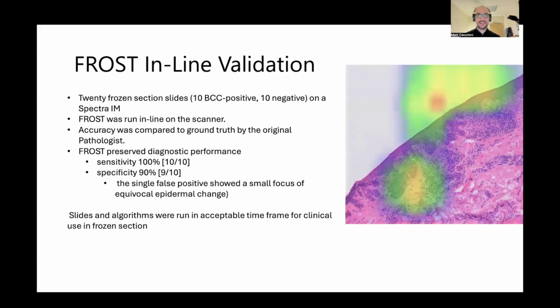There's not a lot of guidelines on exactly what you need, but because this is not giving the answer and because of how we're reporting it, this is just an augment. To me, if it's negative, I still need to look at all the tissue. I'm still responsible for it all. Its real value is just to highlight areas that I should look at and to help me focus my attention on areas that are positive, because once I've found the positive area, I can move on.